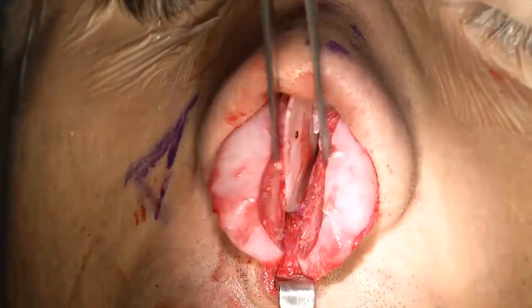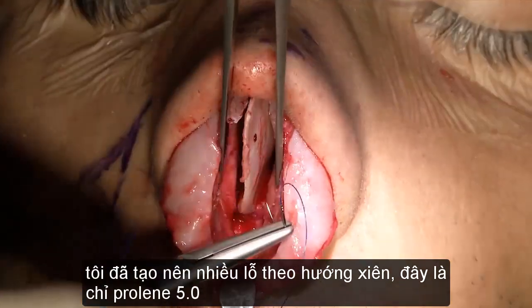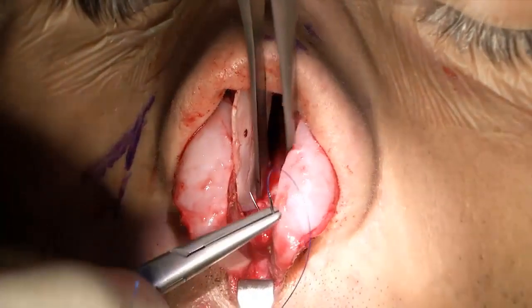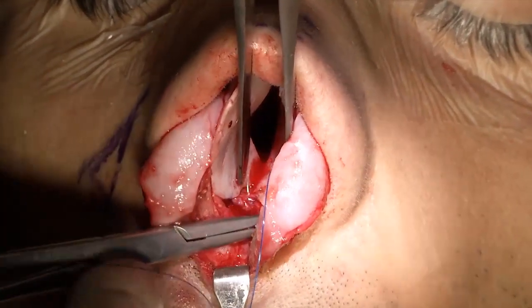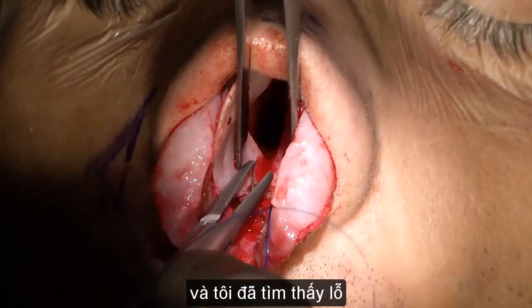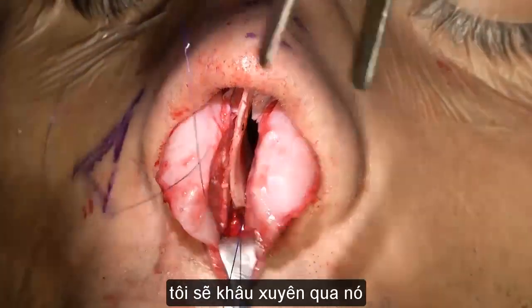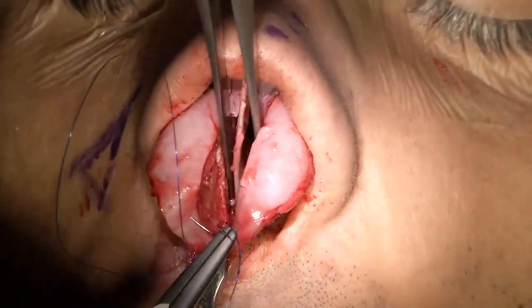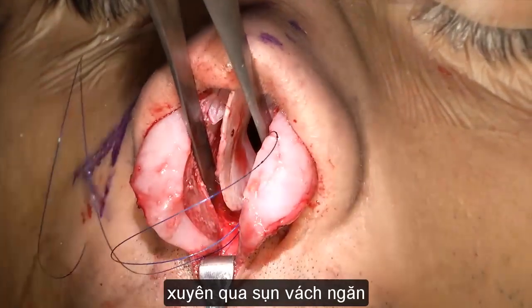Suture. So I made a couple of holes obliquely. So this is Prolene 5-0. And now I found the hole, this time. I will pass it through my cartilage.